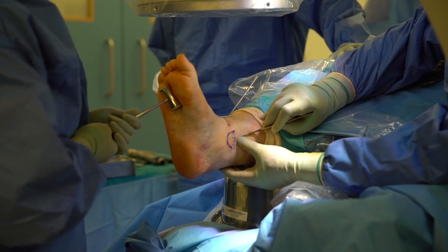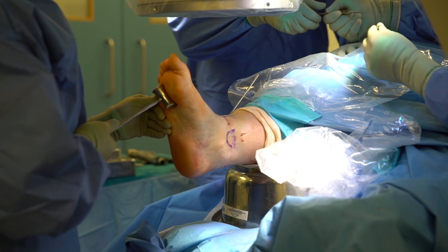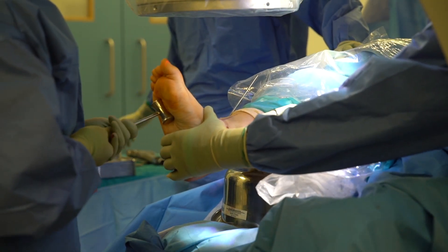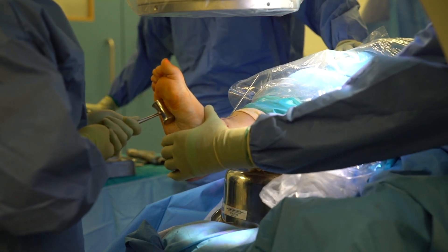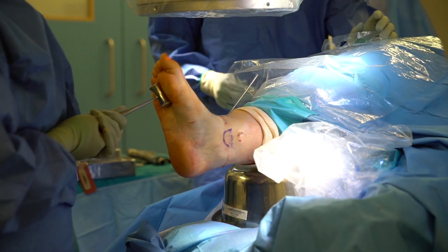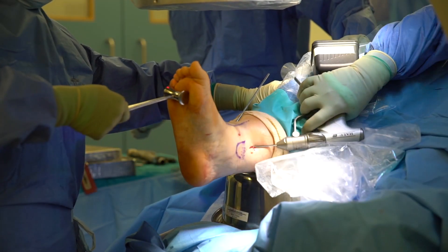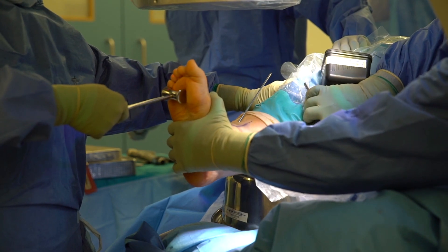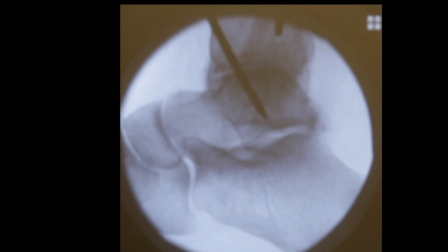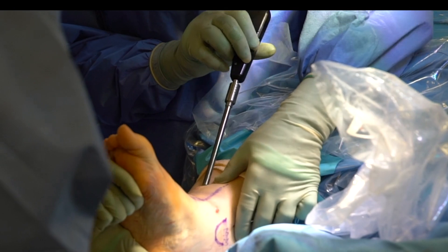The second guide wire entry point is placed medially. A stab incision is made followed by blunt dissection to the bone. The assistant maintains the foot in a neutral position during guide wire insertion. A lateral fluoroscopic view confirms very good positioning of both wires.